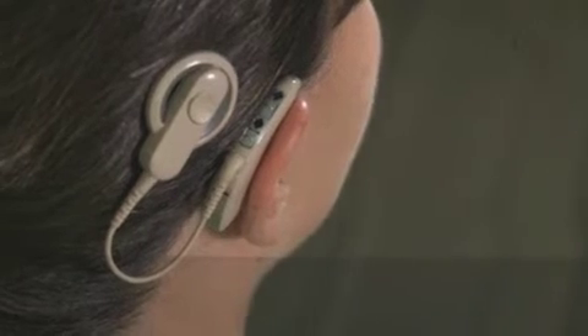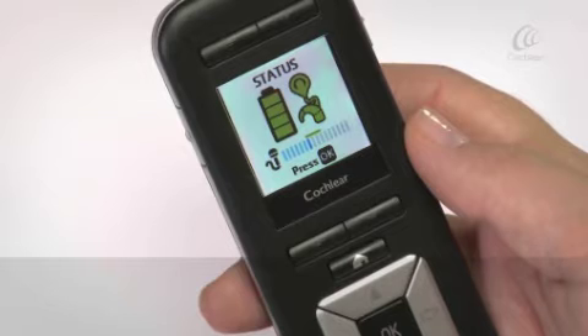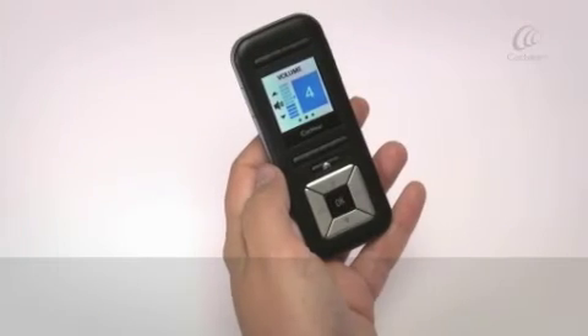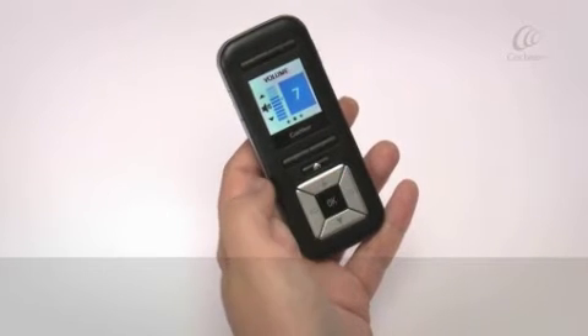Your remote assistant provides easy access to key information about your processor, including the status of battery levels and troubleshooting details. You can use your remote assistant to adjust your processor settings.